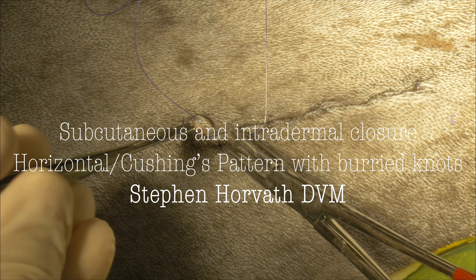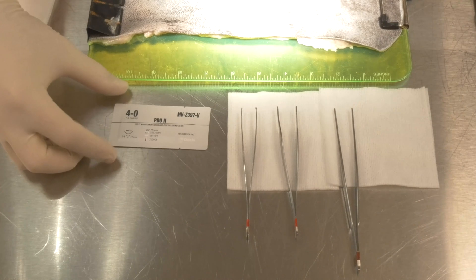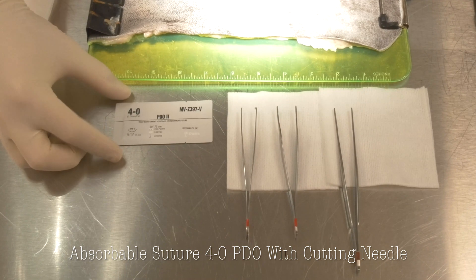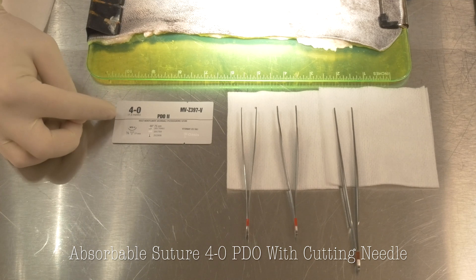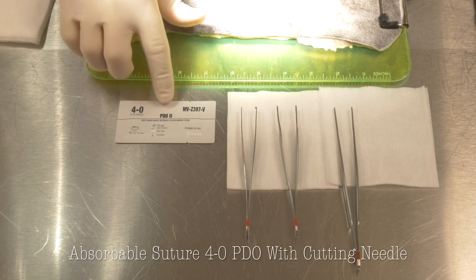Let's first start by discussing what instrumentation we're going to use. When doing subcutaneous and intradermal skin closure, it's important that we use absorbable suture. For subcutaneous tissue, we can use chromic gut, or as we're going to do today on the shelter medicine and surgery rotation, we'll be using a long-acting monofilament absorbable suture. Size 4-0 is what we'll be using — brand PDO on a cutting needle.